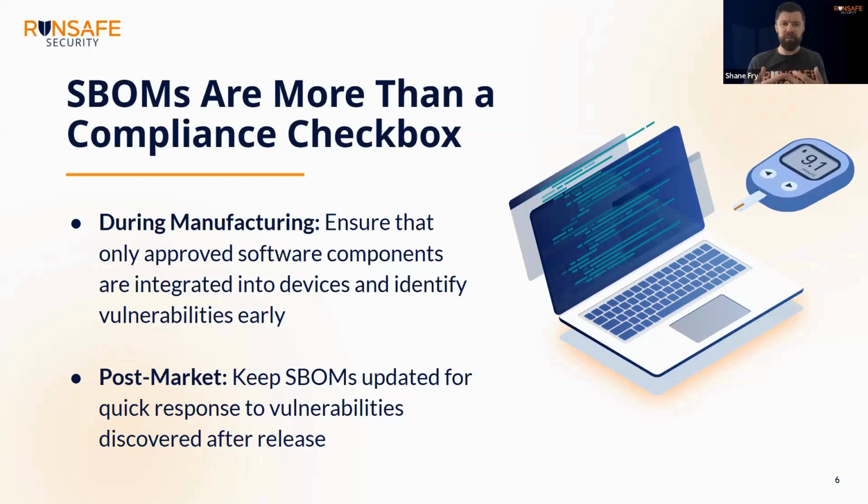And then because ultimately, if a hospital gets hacked, it doesn't matter that the medical device was the problem. It matters that now they can't provide care, right? And so, they have a duty to make sure that their software is up to date and has less vulnerability. So, on the manufacturing side, it can be a really good indicator for whether or not you should ship software.